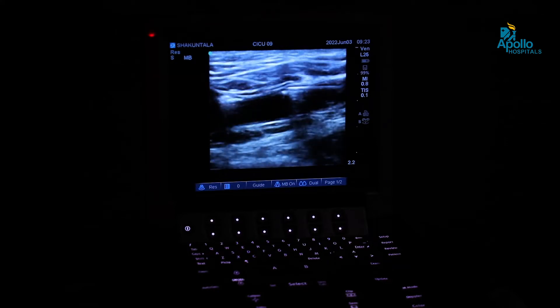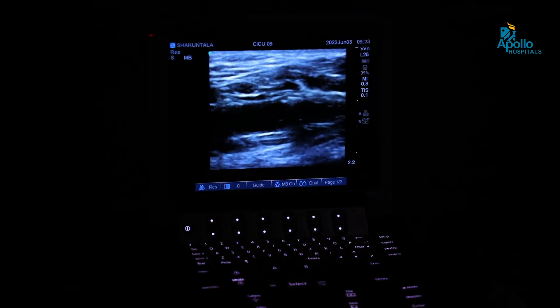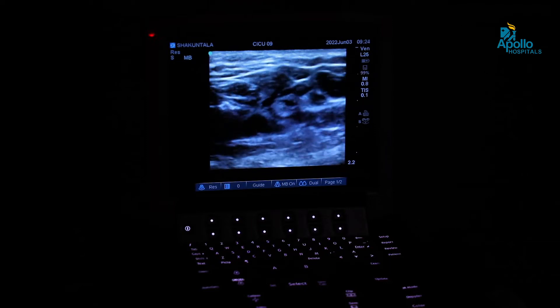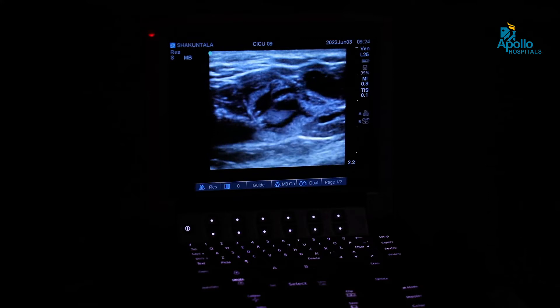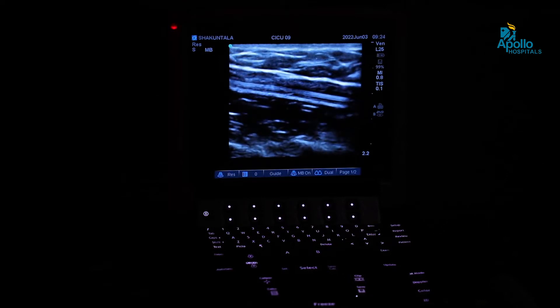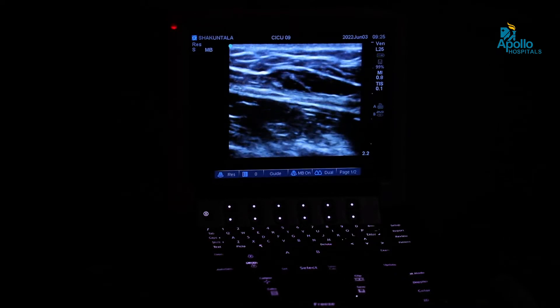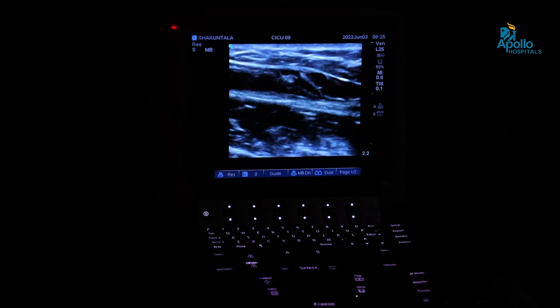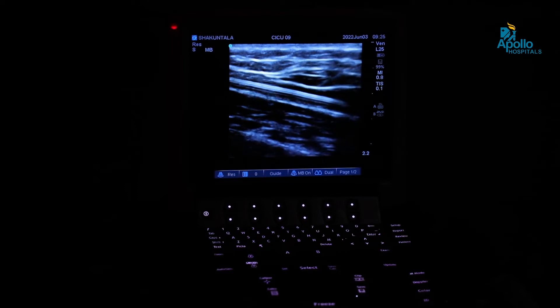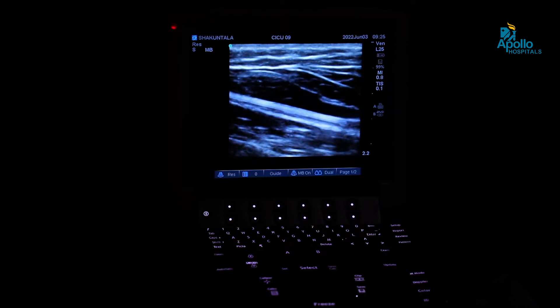In this present scenario the vein is very big, so tumescent needs to be given. We are injecting tumescent normal saline next to the vein so that it compresses the vein, ensuring good approximation of the laser fiber with the vein and a good laser effect. You can see the needle coming around the great saphenous vein as the tumescent is given, causing the vein to collapse so the laser effect will be good.